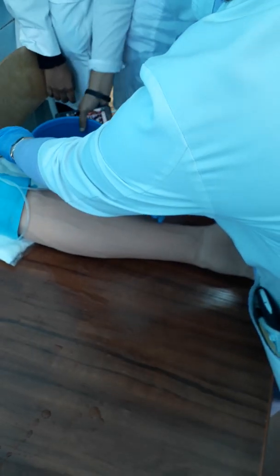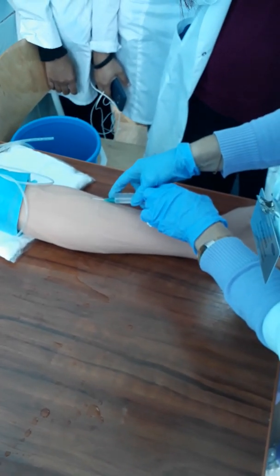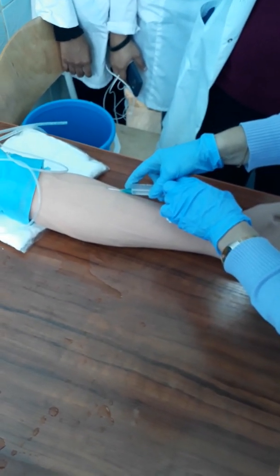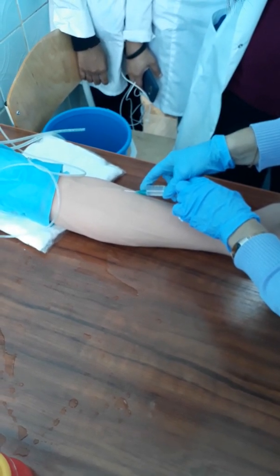And if you see blood inside the syringe again, you administrate the solution with middle speed, not very fast.